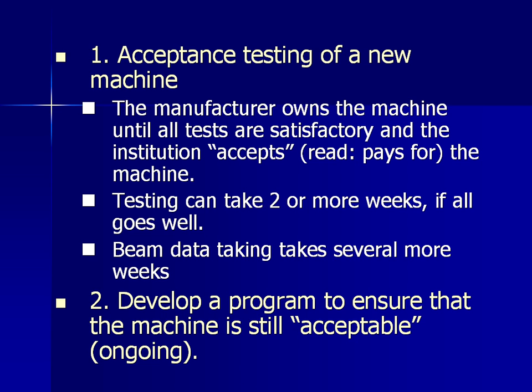So yes, here you would hope that we have lots of people, and it's more likely we're going to have double checks, and maybe the RPC will come in, and it's easy for them to come in and double check things for us. Would you say, George? Yeah, I'm not sure exactly what our procedure is now for commissioning, say, a LINAC.